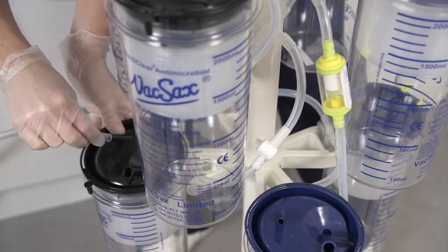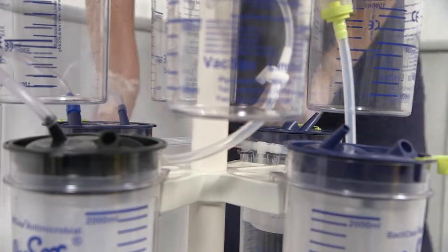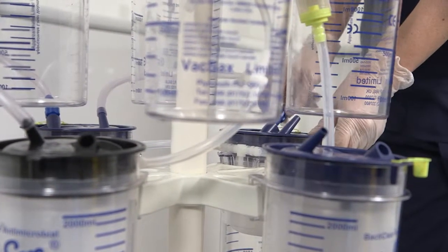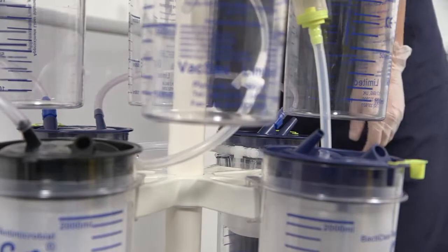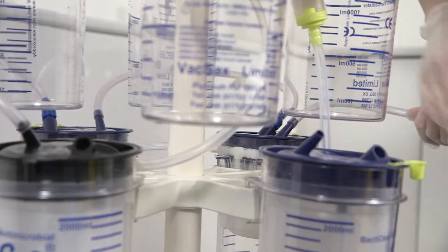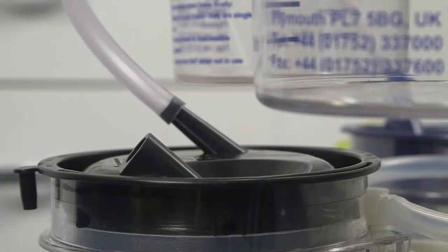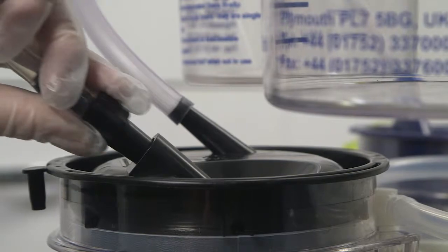Then, moving to the bottom canisters, do the same — working from the black lid liner, connect the blue cascade tubing as shown. Connect the black vacuum tapered connector to the bottom row black standard liner.